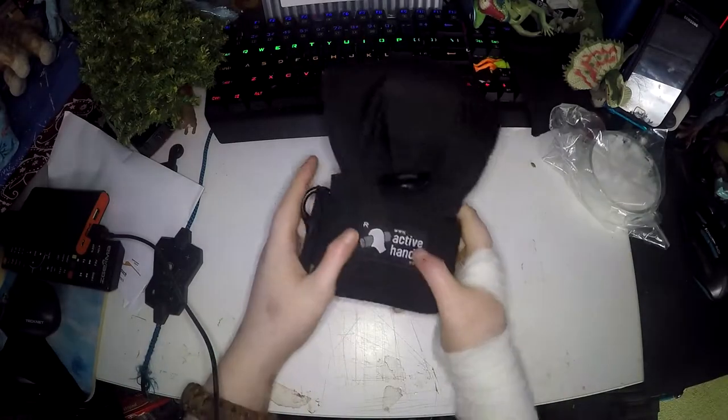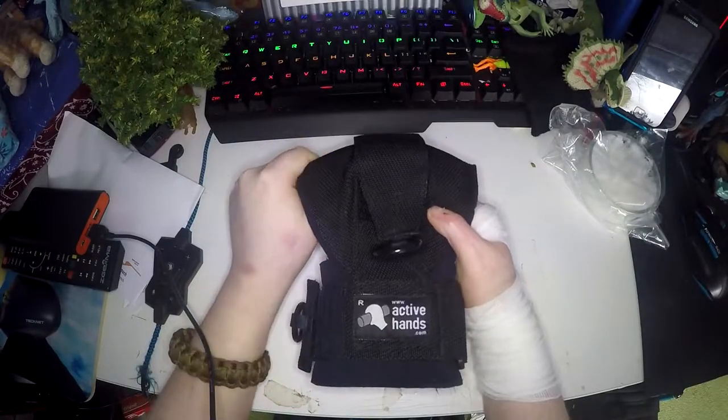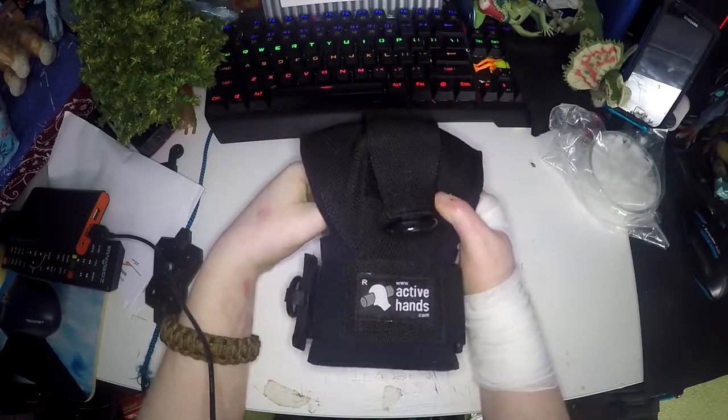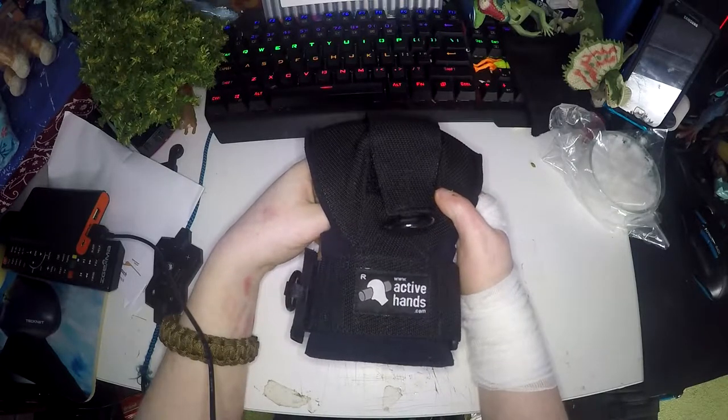Here I have for review the Active Hands General Purpose Gripping Aid. This is a gripping aid for if you have weak hands or even if your hands are paralysed. This will allow you to be able to grip onto things properly and not have to worry about letting go or things falling from your hands.